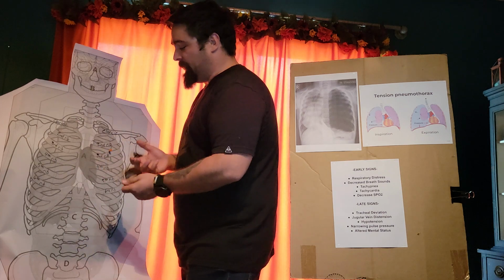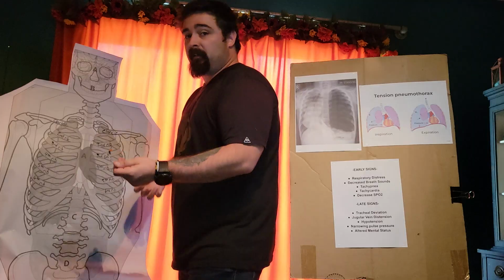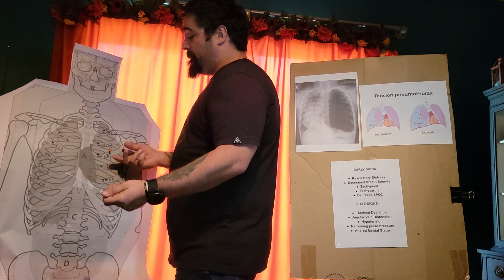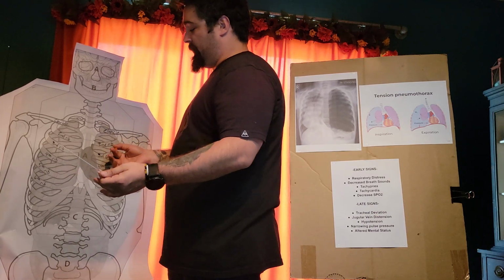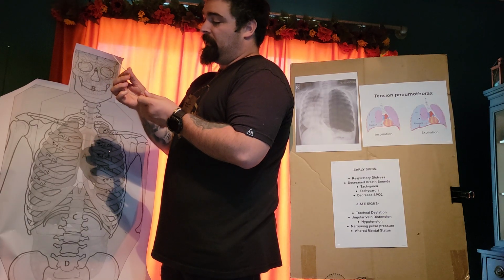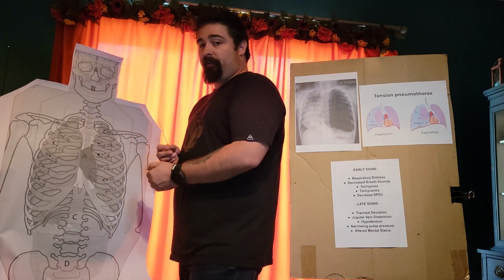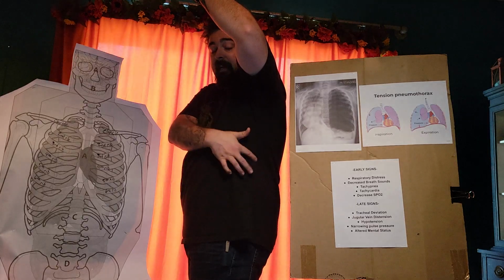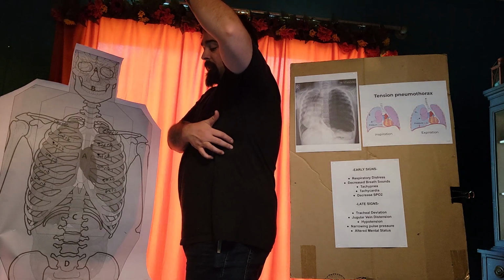You'll typically get a couple seconds of relief. That pressure will decrease inside the pleural cavity. The lung will be able to expand, and then that can be left in until it's no longer effective. We'll cover that in just a second. So for the other site, we're looking at the 4th or 5th intercostal space at the anterior axillary. So you're looking here, typically mid-axillary, just front of that, you're looking at anterior axillary.